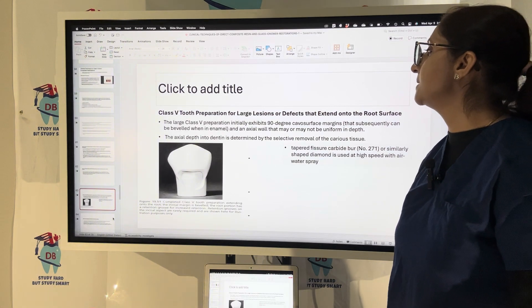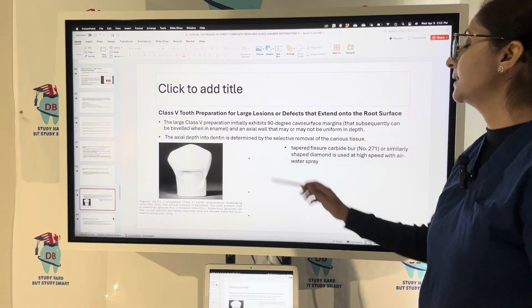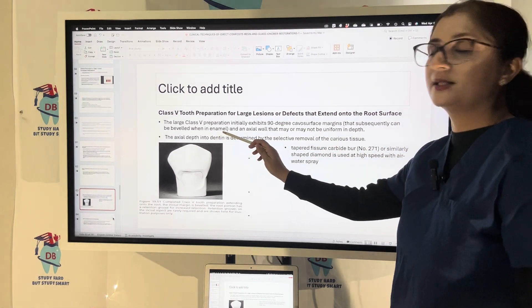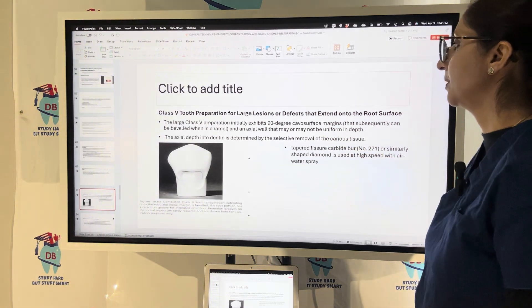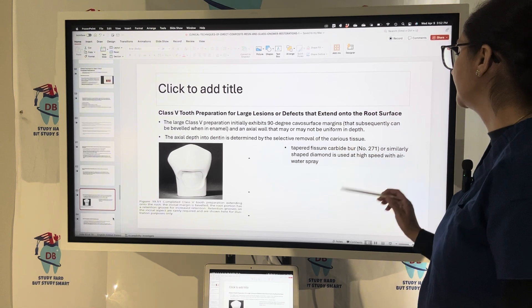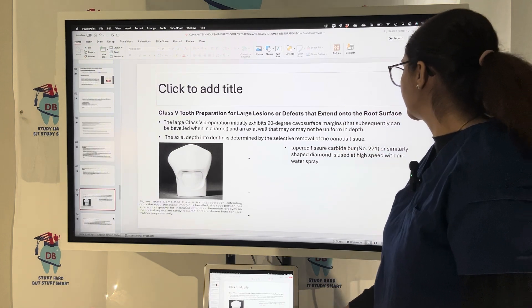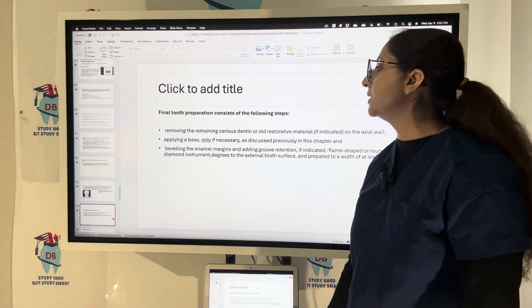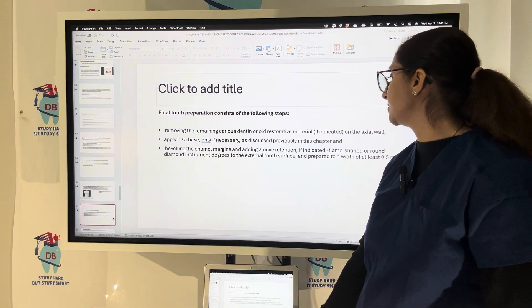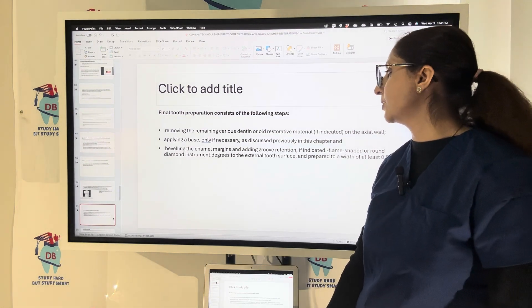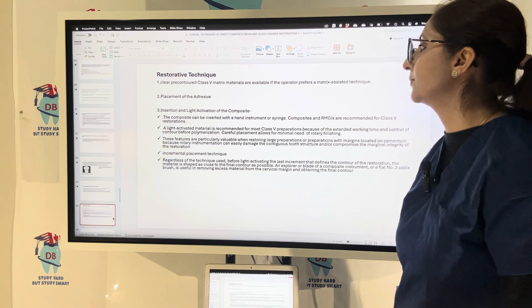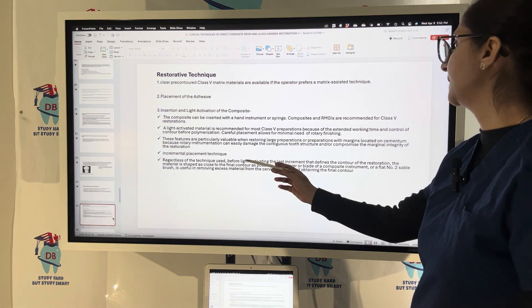For a large Class 5 lesion or defect extending onto the root surface, the preparation exhibits a 90-degree cavosurface margin that can be beveled in enamel, and an axial wall that may or may not be uniform in depth. Axial depth in dentine is determined by selective removal of carious tissue using a tapered fissure carbide bur number 271, and a similarly shaped diamond at high speed with air-water spray. Remove remaining carious dentine, apply a base only if required, bevel the enamel margin, and add groove retention if indicated. Clear pre-contoured Class 5 matrix materials are available; place adhesive, insert and light-cure the composite using incremental placement technique.